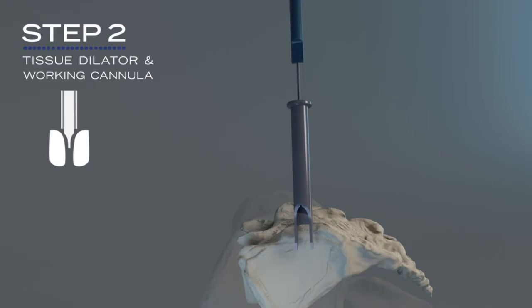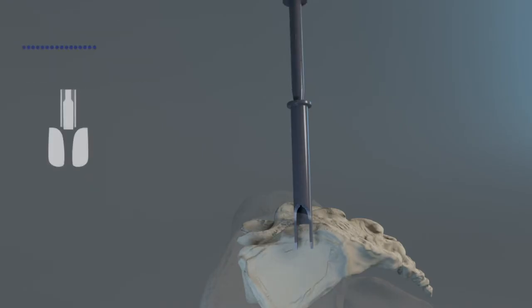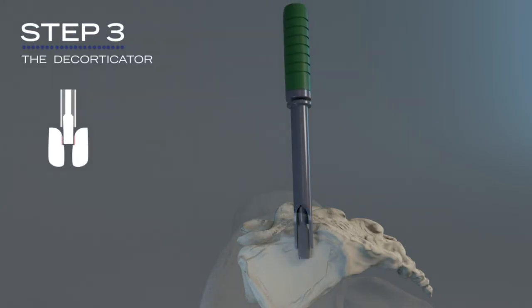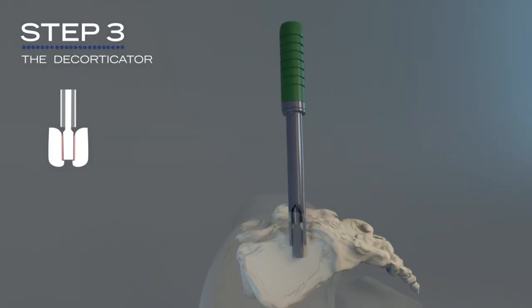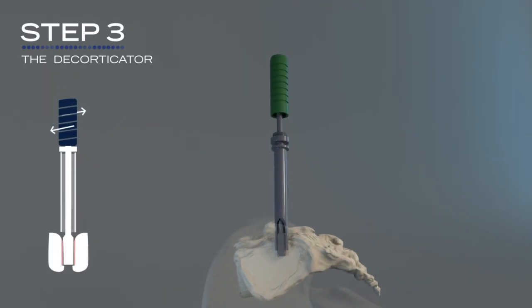Then, the broach rasp is inserted to create room for the link allograft to fit comfortably and at the same time initiate decortication. The broach and rasp are removed with a simple unscrew, reverse hammer, and pull motion.